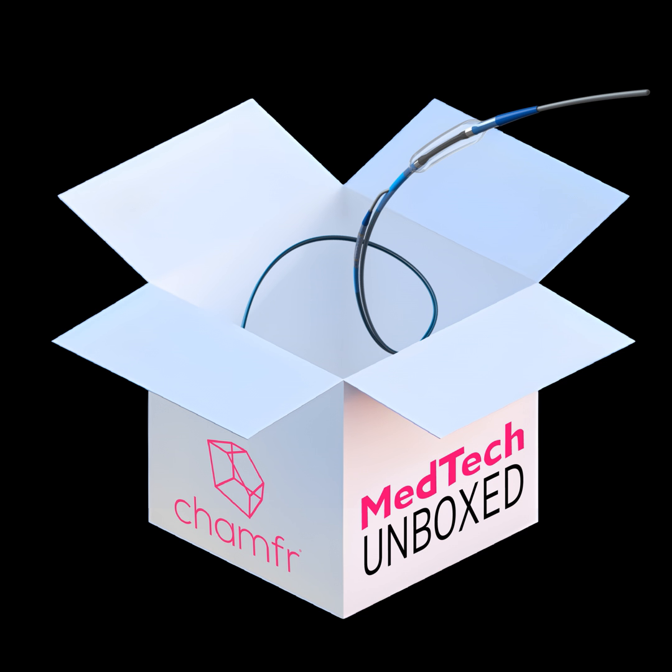Yeah, I can see that. There's books and there's patents that you could look at and just general catheter information, but to qualify it further and test it even before you get to the bench is, I would think, a very good tool to have to shorten that design cycle. Exactly. The other alternative is to prototype everything, and that's expensive and it takes a long time. Right. And anything you can do to shorten that iteration cycle is very helpful.